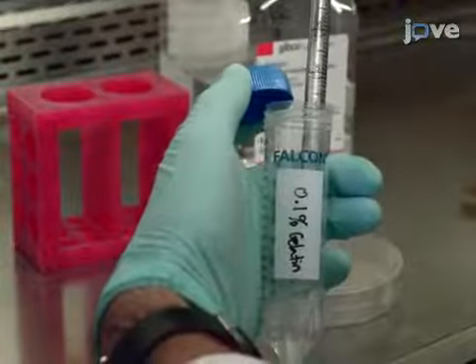To begin, add 0.1% gelatin in PBS to a 10 centimeter dish.